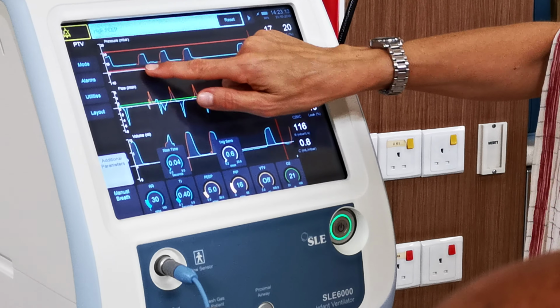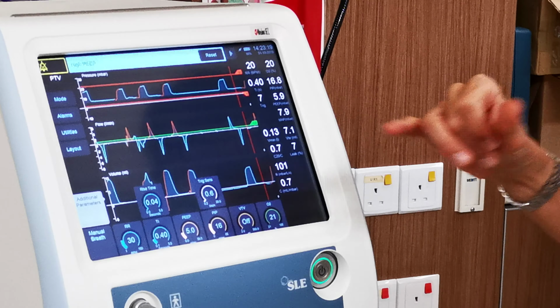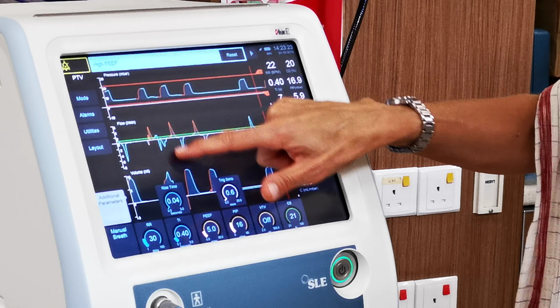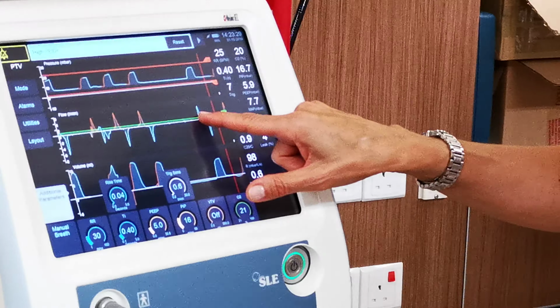You see the waveform is turning orange. It's telling you that the patient started the breath. So your patient has a spontaneous breath. That's why it's orange. And you are in a mode where each time the baby takes a breath, you see the ventilator will synchronize with your baby. So what happened here?